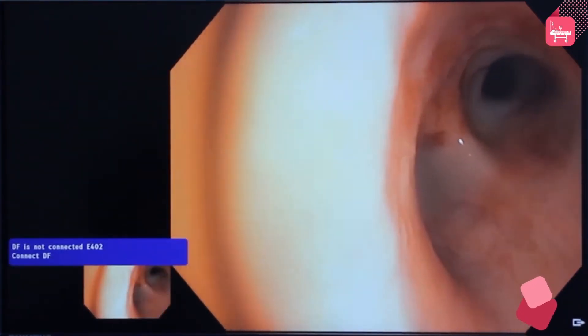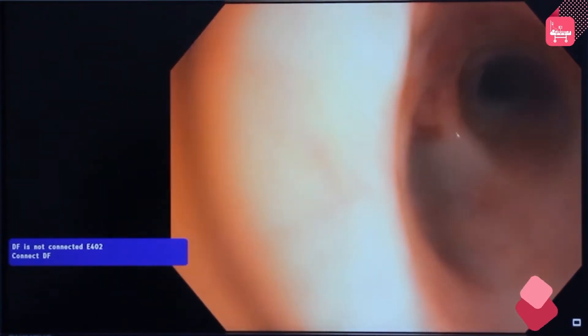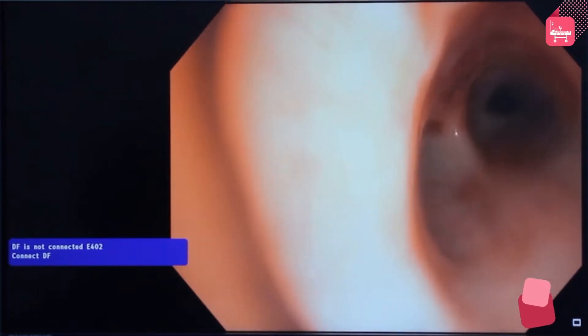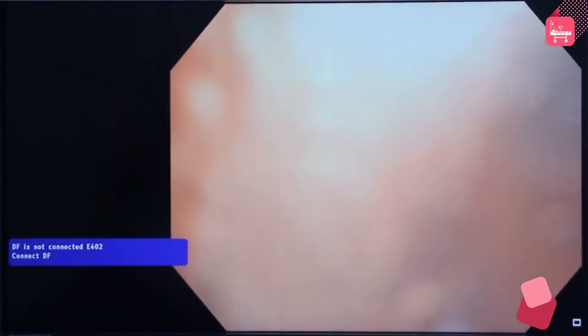Now insert the bronchoscope into the right main bronchus. There, the right upper lobe is seen with three openings. The right upper lobe openings are filled with mucus secretions.